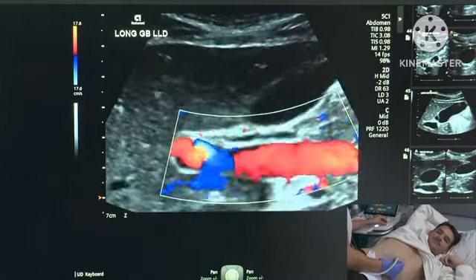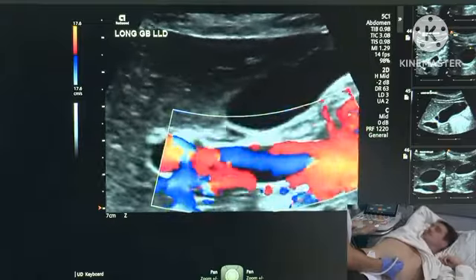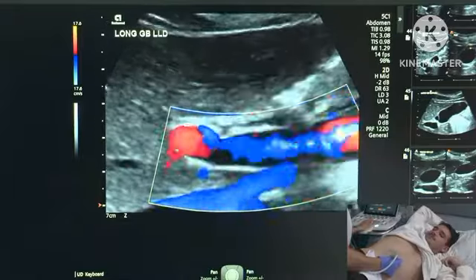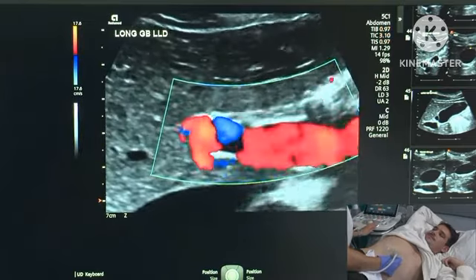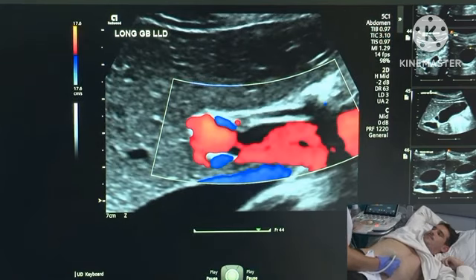And what I'm doing now, because I'm live scanning, I'm changing my right zoom. So big breath in. Good. Hold that breath. There we are. Good. And breathe. So you can see this tubular structure here, which is my bile duct.